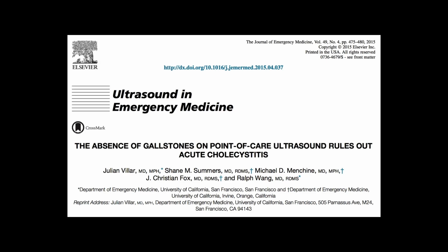Next study here is published 2015 by Chris Fox and his colleagues as well. And I found this one interesting, right? Because one of the critiques, or maybe the aggregate critiques that I've heard over the years, is like, man, this isn't easy. I don't feel confident. And particularly, I can't find this common bile duct, right? Where bedside ultrasound shines, we have a quick, easy yes, no question that we can answer, and then it has a very clean if, then, else outcome.